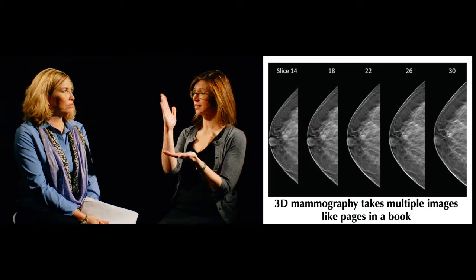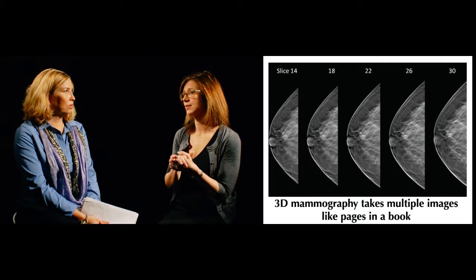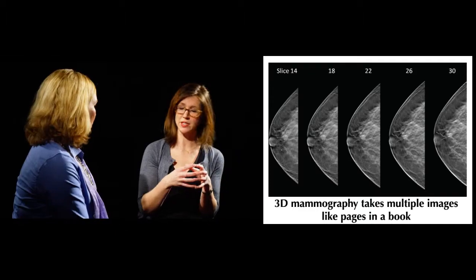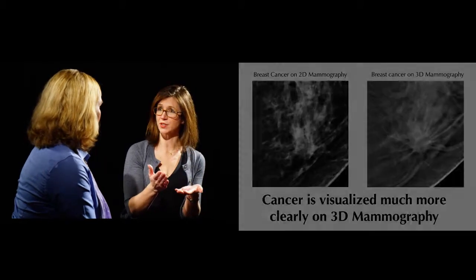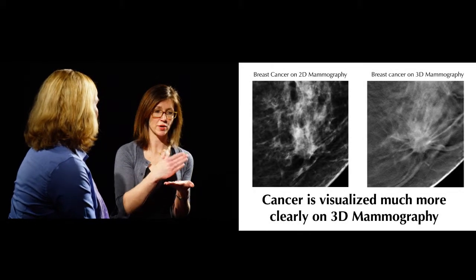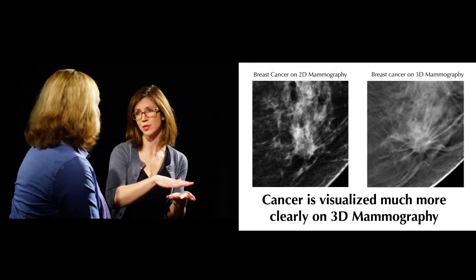You're welcome. So basically, what is the difference between a 2D mammogram, which is a traditional mammogram, and a 3D mammogram? So a 3D mammogram is used in conjunction with your 2D mammogram. So you're actually taken together. So your 2D picture is taken, the traditional mammogram like you're used to getting, and then the machine now moves over your breast in an arc, takes multiple pictures as it's moving over your breast. And a computer takes all those pictures and it generates a 3D picture of your breast. And the radiologist can now go through that and flip through those pictures like pages in a book. And so it's much better look at your breast than trying to look through the entire book like a 2D mammogram.